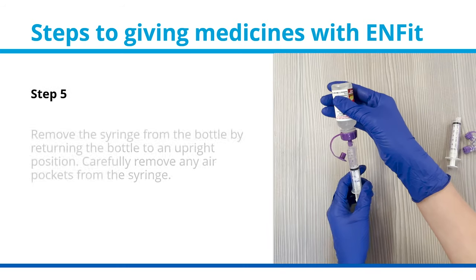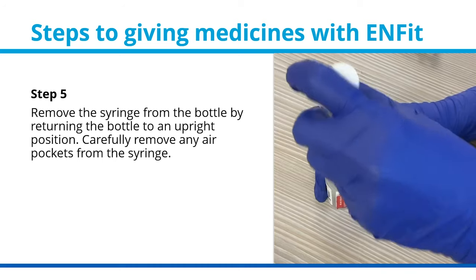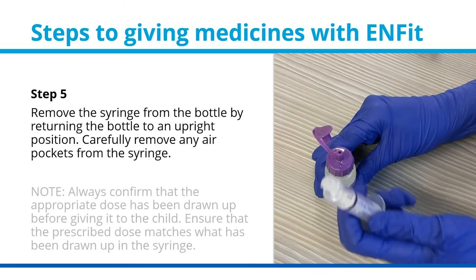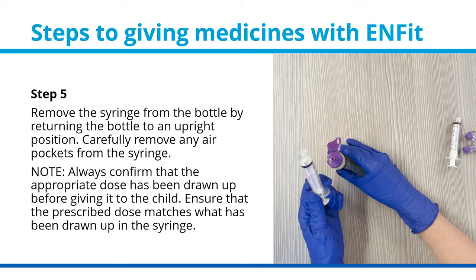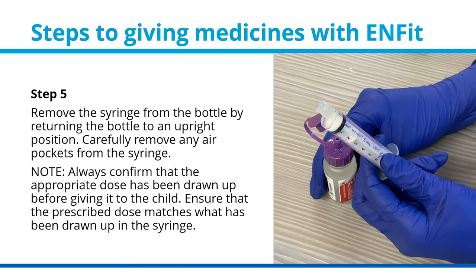Step 5: Remove the syringe from the bottle by returning the bottle to an upright position. Carefully remove any air pockets from the syringe. Note: always confirm that the appropriate dose has been drawn up before giving it to the child. Ensure that the prescribed dose matches what has been drawn up in the syringe.